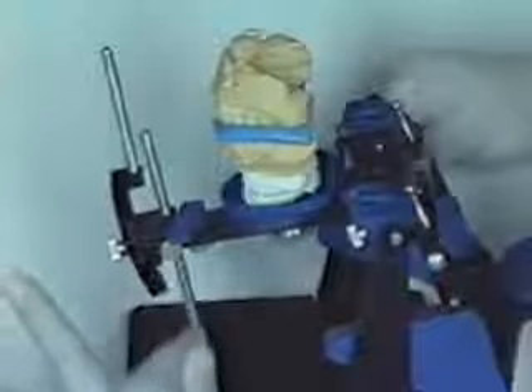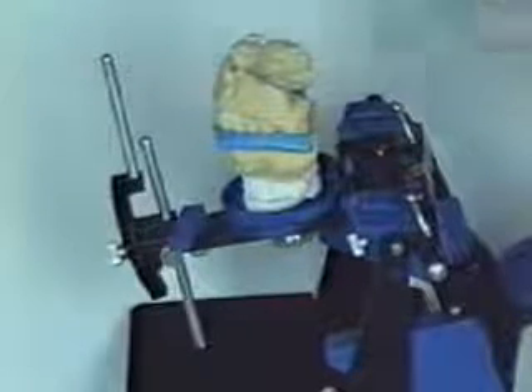An additional unique feature about the Panadent mounting system is the ability to adjust the support pin. In this way, the support pin can be adjusted so the mandibular cast is lowered so that it is perfectly level, to minimize any stone that may drip down the back onto the articulator.